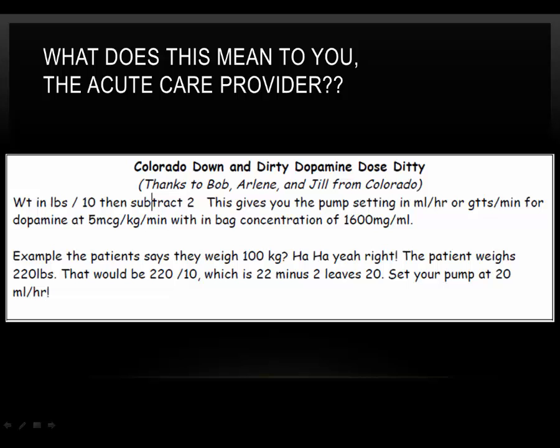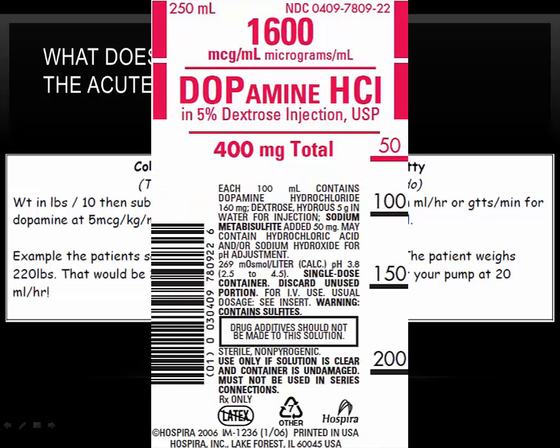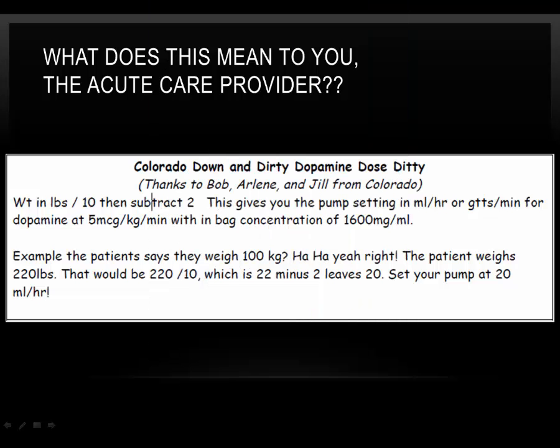Before you give a med, other than oxygen, make sure you determine the presence or absence of a bundle branch block. If the QRS is wider than 120 milliseconds and you are going to give a vasoactive drug such as nitroglycerin, remember, before giving nitro, always check the lung fields for crackles, especially the posterior lobes. Listen to the heart sounds such as S3 and S4. Always have a Plan D ready. Plan D is actually the drug dopamine or Intropin. The dose for contractility support is 5 micrograms per kilogram per minute, then titrated.